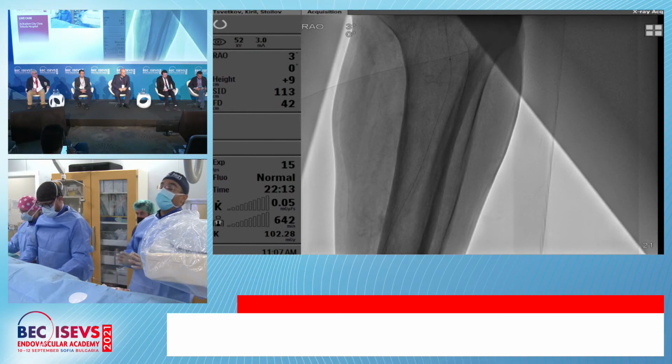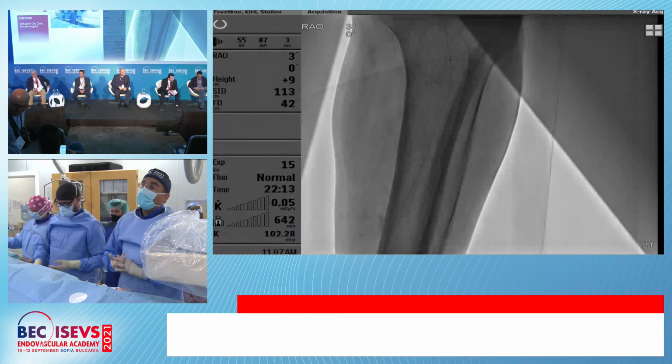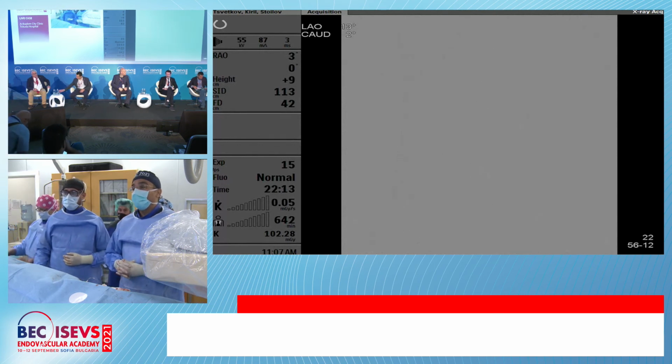Theo? Hello. What is the situation? Okay, let's go back to the intro. We have already performed chocolate balloon, then a DCB, and then a stent and a DCB, and we have recanalized. You can go back, please.